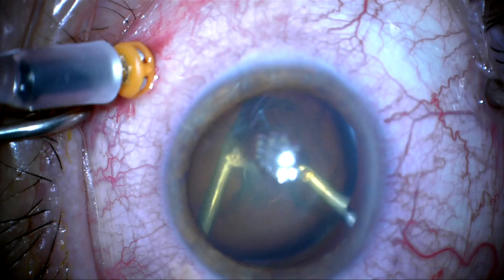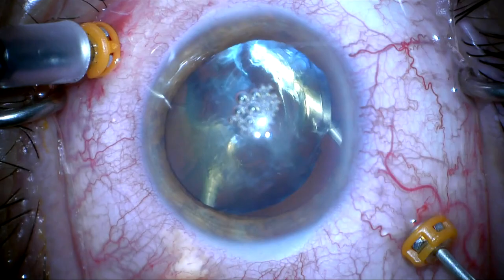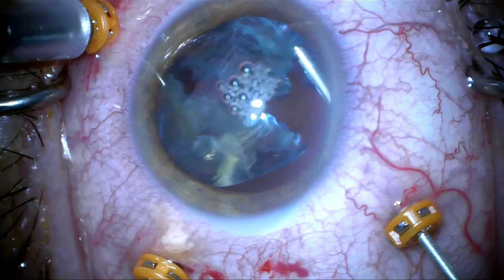I'm supporting the lens with the light pipe and pressing it up against the back of the iris, trying to keep the capsular bag basically intact so that I don't lose pieces into the posterior segment. I'm holding the lens up against the back of the iris with the light pipe and taking my time vitrectomizing this.